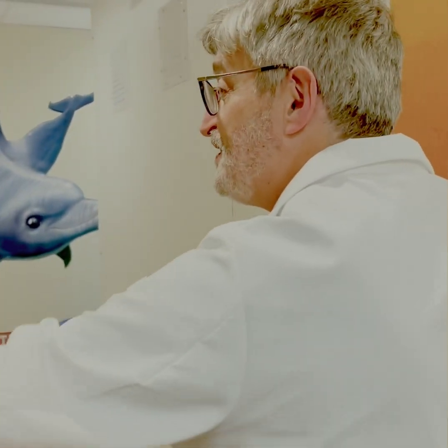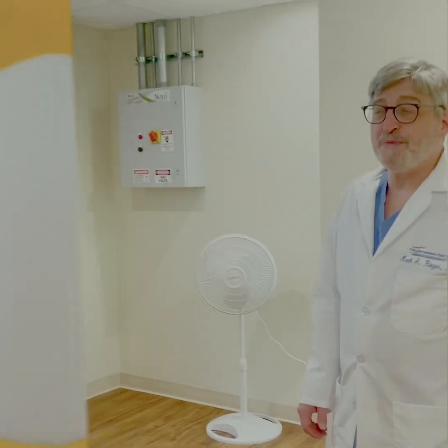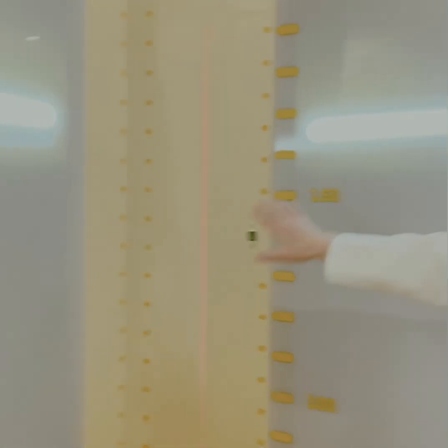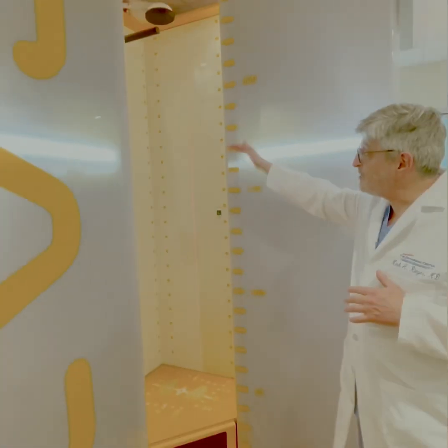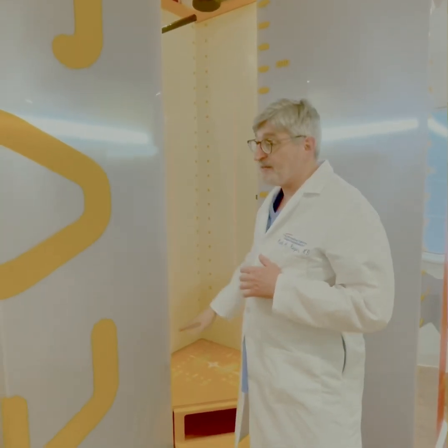As you can see here, lots of technology behind this machine. And as you'll see in a moment, what happens is the patient will get into the machine over here and simply stands. And when they stand, there'll be two linear beams that come down. You can see the white lines here. They start from the top, come down.